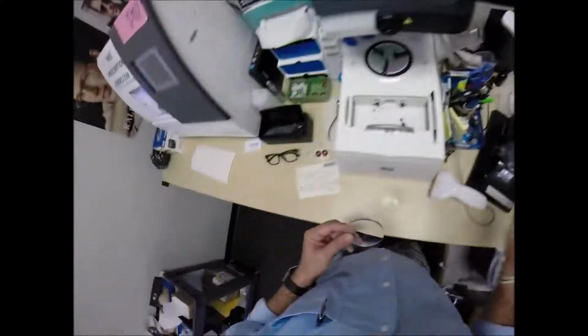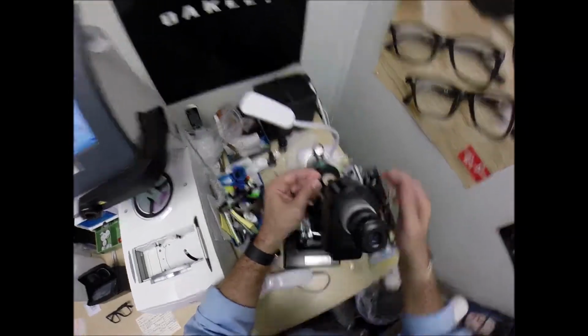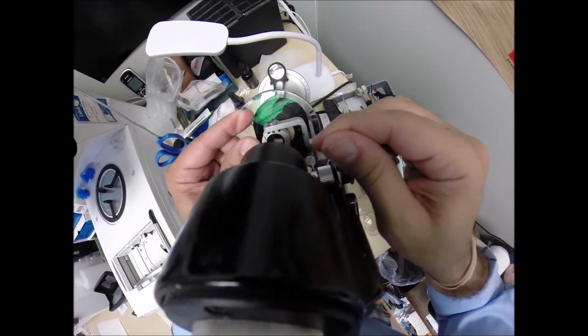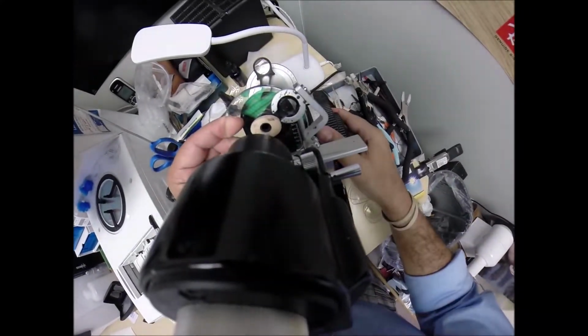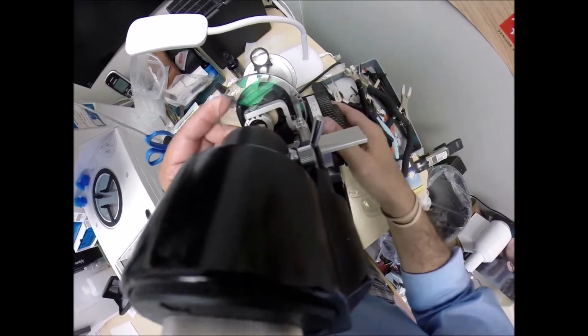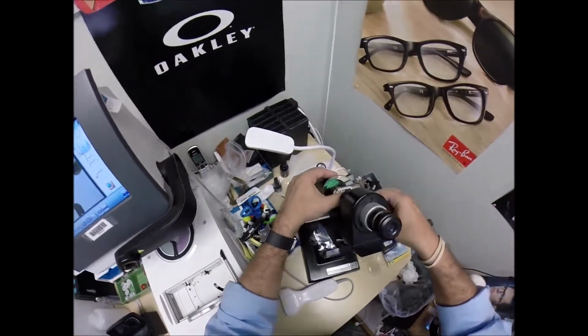So I'm going to turn the axis wheel to 2. Make sure we're going to put the power drum back to 0. Put the lens in, rotate until the spherical component comes into view first, and check the astigmatism correction, which is most of this lens. Actually, it's all the power in this lens. And I'm going to put 3 dots on the lenses.